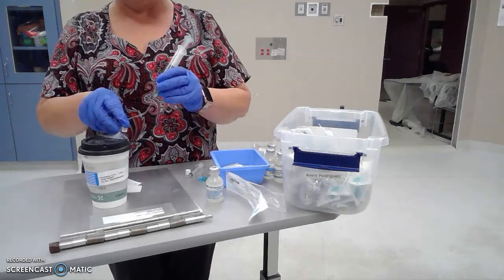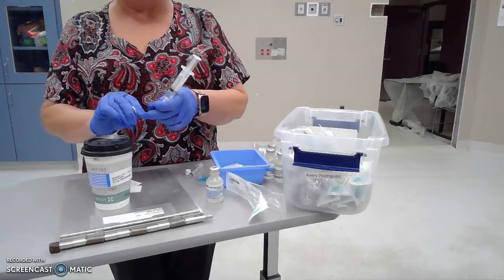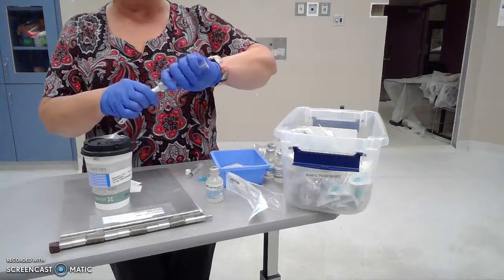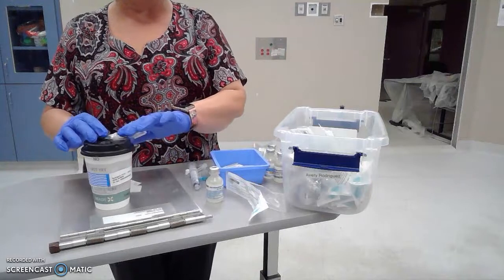Then I'm going to clamp this tubing, take off my flush, then you check on your patient, then you go document what you have just done.